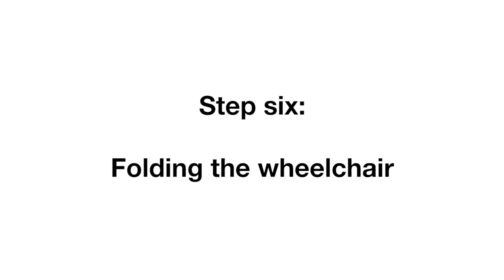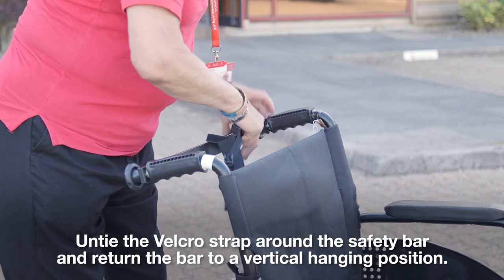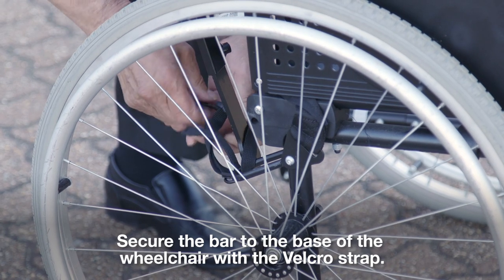Step 6: Folding the wheelchair. Untie the velcro strap around the safety bar and return the bar to a vertical hanging position. Secure the bar to the base of the wheelchair with a velcro strap.